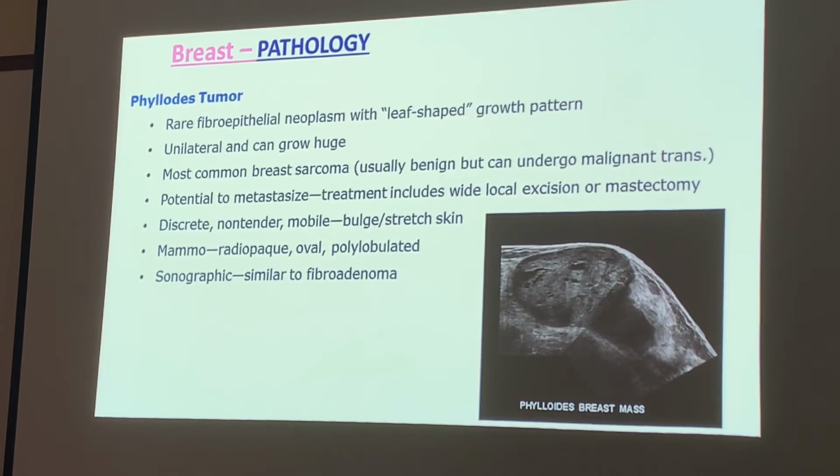Where's the leaf shape pattern? I don't see it very well here. I remember some images I looked up where you can see it a lot better. It's shaped like a leaf, with those veins. Those veins are going to be those fluid-filled slits. Again, I use the pictures from the book, because those are the pictures you guys are going to be able to see, so I want to use those instead of finding new pictures.